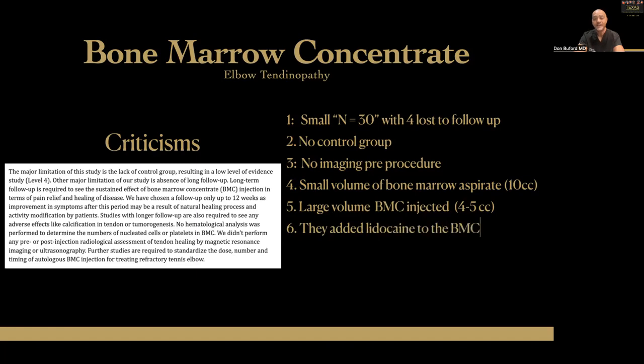Number 6, they added lidocaine. We do not use lidocaine. We sure don't add lidocaine to any syringe that has an orthobiologic in it. Okay. We just don't do that. The best data suggests that that is a tactical error and can make whatever you're trying to do not work.